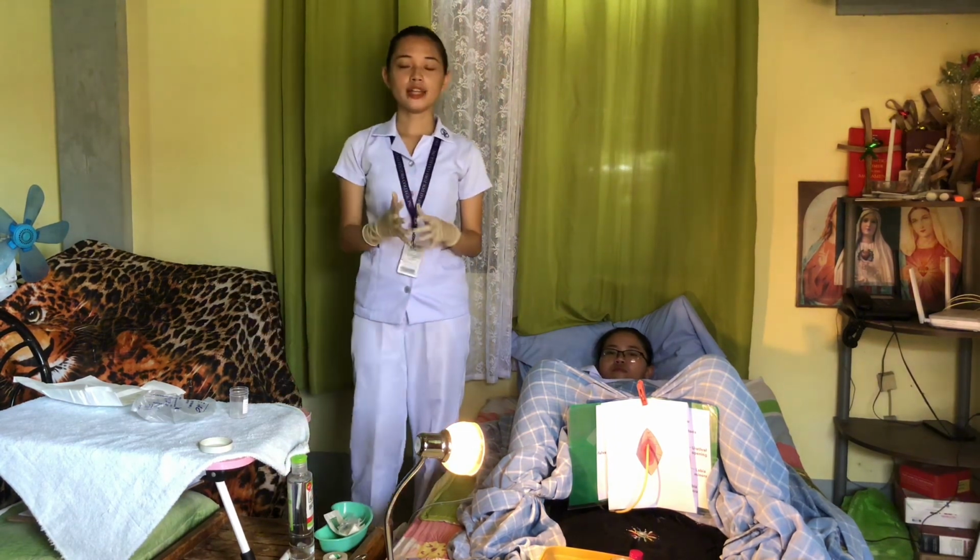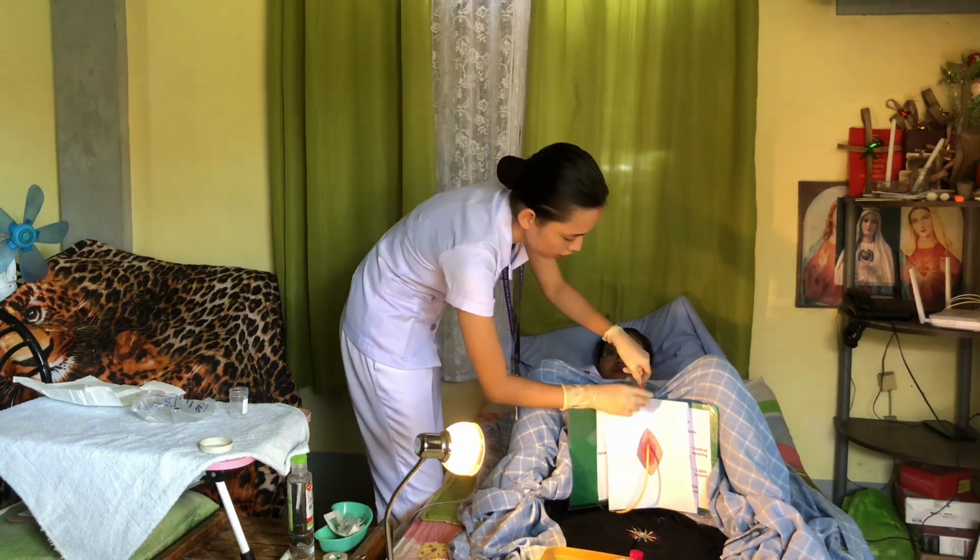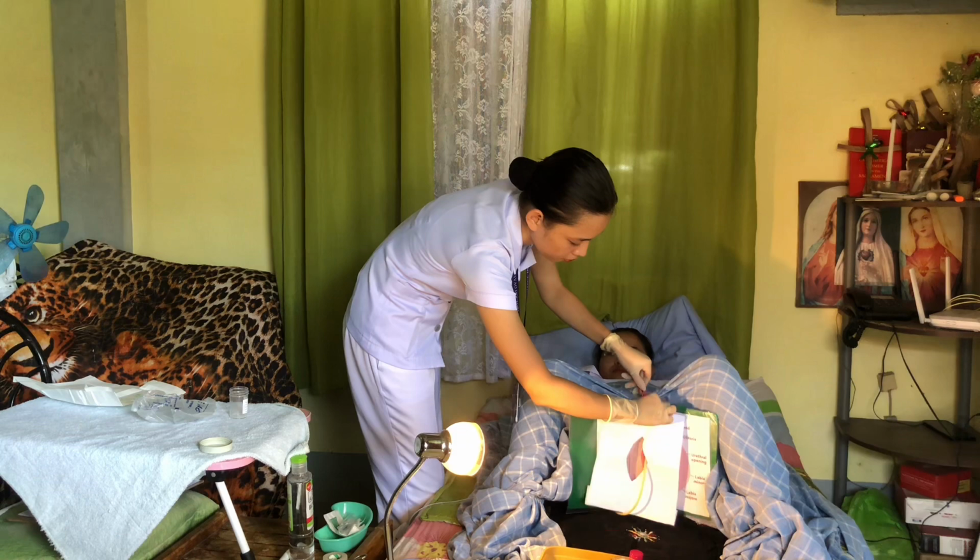Okay, after that, I will remove this eye sheet and place the patient in a comfortable position.